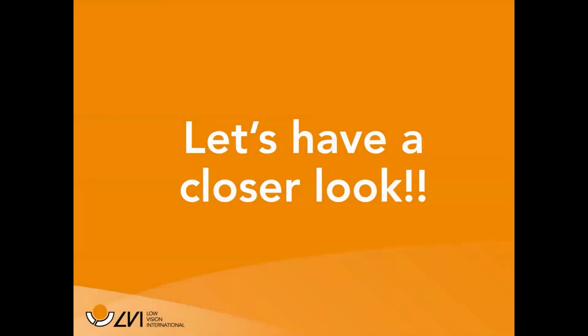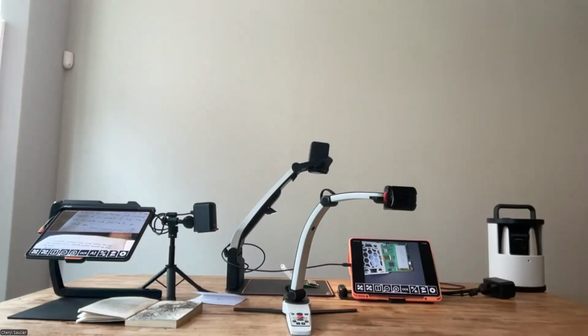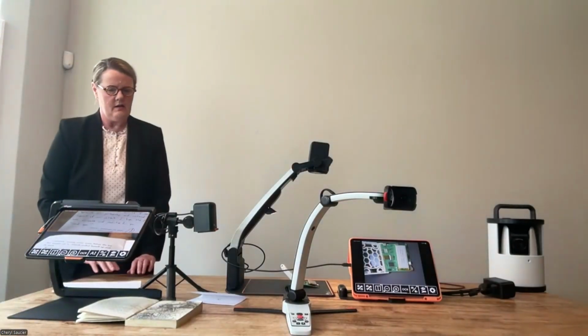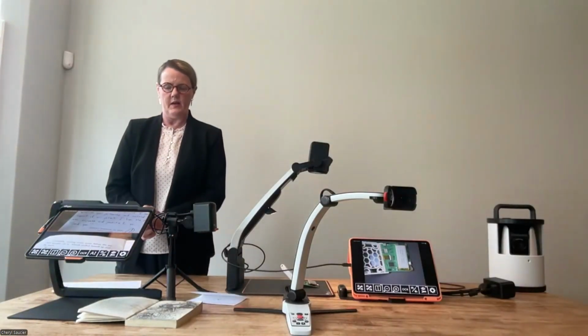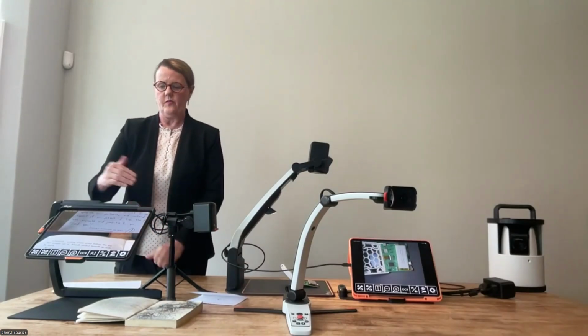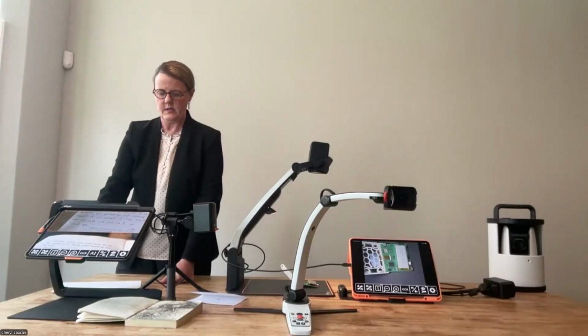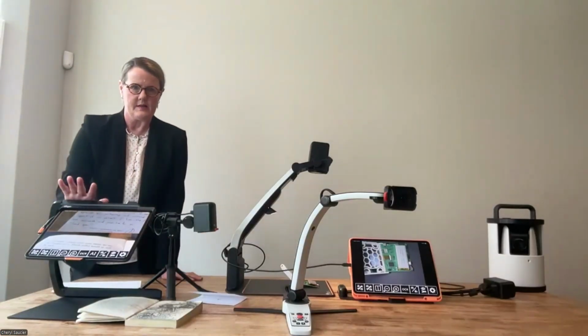So let's have a closer look. I tried to set some things up here to be able to show you what some of these products actually look like. So let's maybe talk about them in the order that we went through in the presentation. The first one would be our iTab. So this is our iTab product. It's the one that I talked about that has the stand.